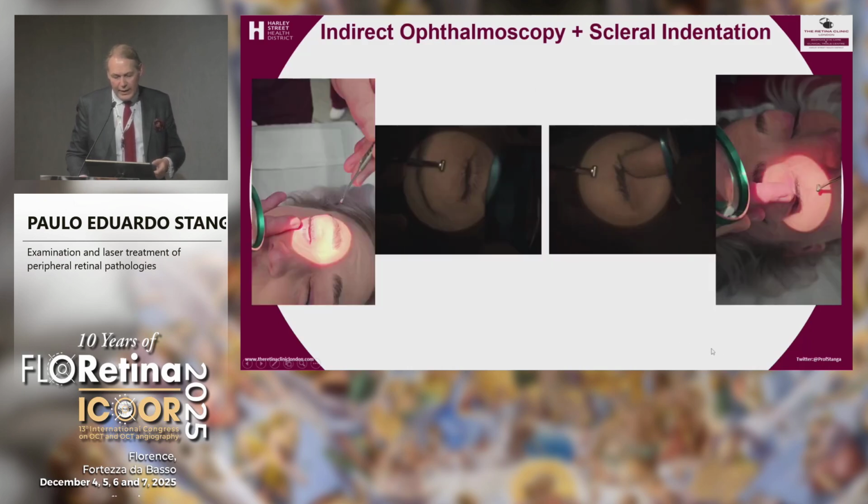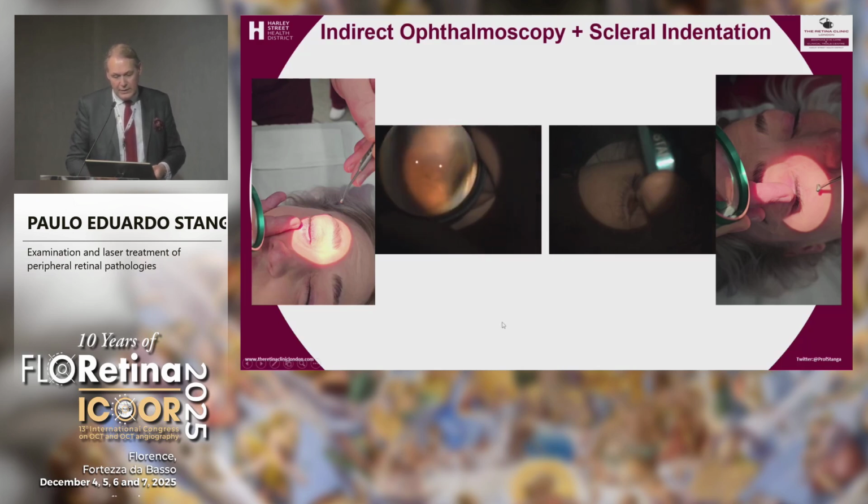And here we go again, the other eye. There's less skin when we do the 6 o'clock, but as you could see, I'm not pressing, and I'm there directly, right on the, look, there it is, the ora. I'm right at the ora. And you have to play with that reflex. You coordinate your hand with the head. And there again.